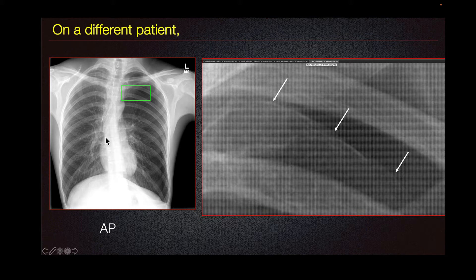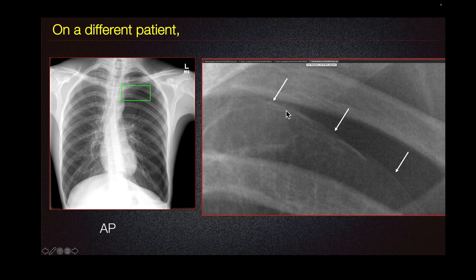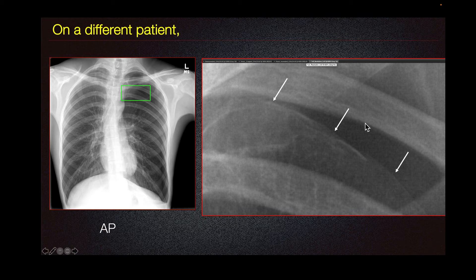The first modality used for evaluation of pneumothorax is a chest radiograph. We can see a visible visceral pleural edge as a very thin white line with no lung markings peripheral to this line. This is consistent with a pneumothorax.